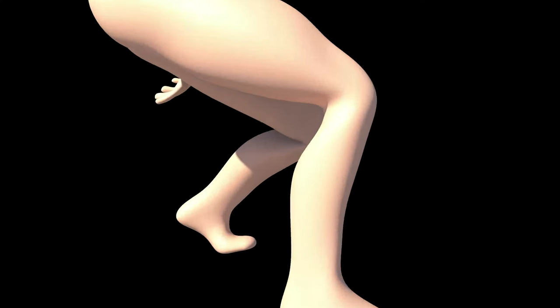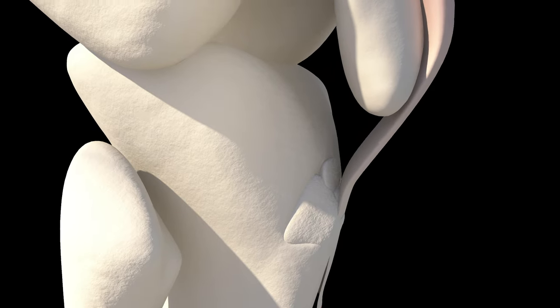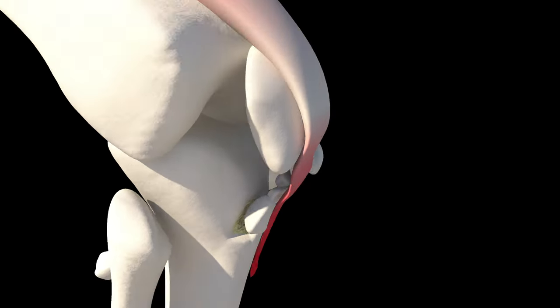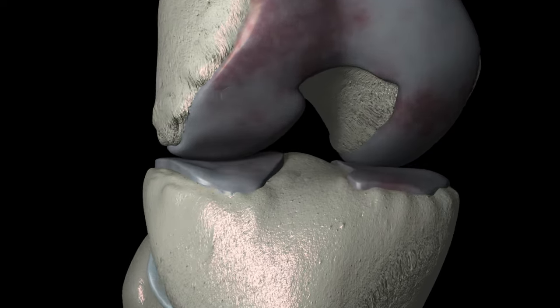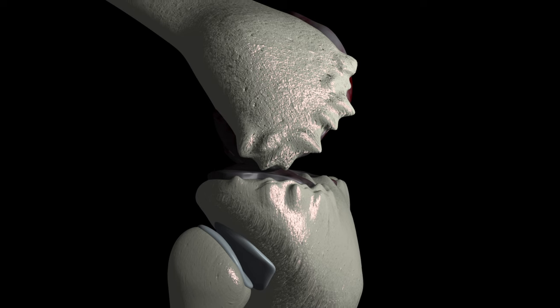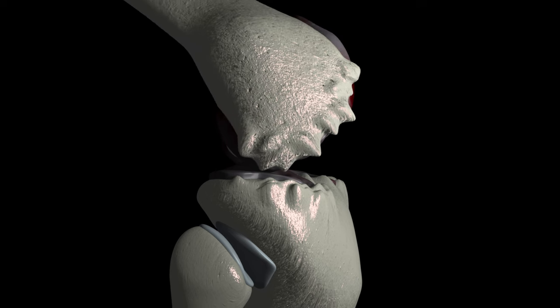Do you have knee pain or a brand new injury that you're looking to get through so you can get back to your activities? Do you have chronic osteoarthritis and you're wondering if there's a brace out there that might make things feel a little bit better so you can keep doing the activities you love?